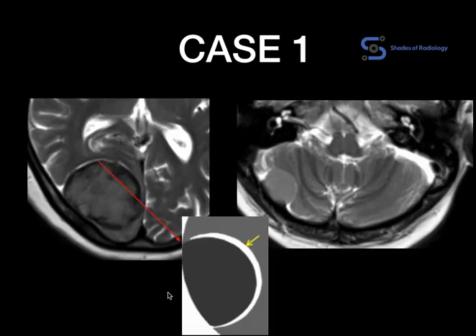Let us look at Case 1: a posterior fossa or occipital meningioma on the right side. You can see a CSF cleft and small pial vessels interposed between the lesion and the cerebral cortex. This is called the meniscus sign or CSF cleft sign. In another case along the cerebellar convexity, again the CSF is interposed between the lesion and the cerebellum.